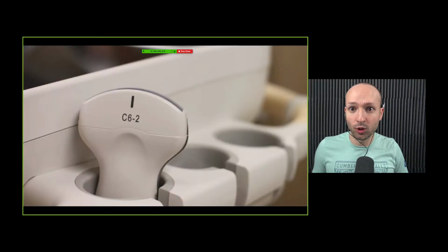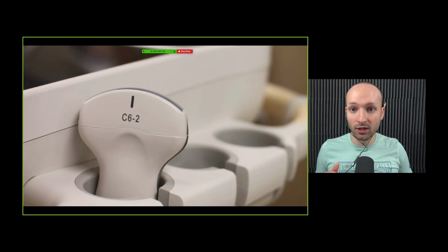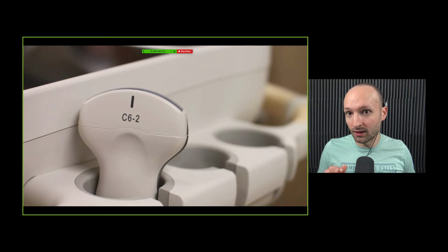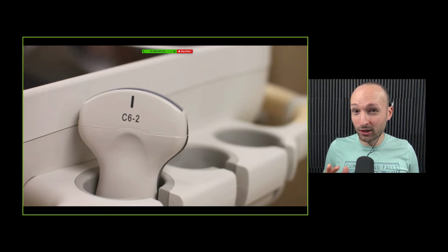Now, as far as the probe to use, the curvilinear transducer is a probe I would suggest for the vast majority of lung pathology. It's got the best combination of resolution, depth, frequency. The phased array has an advantage in which the window that I can look through can look in between the ribs. But I'll show you in a bit why that doesn't really matter with the curvilinear transducer, because there's a way you can get around that.